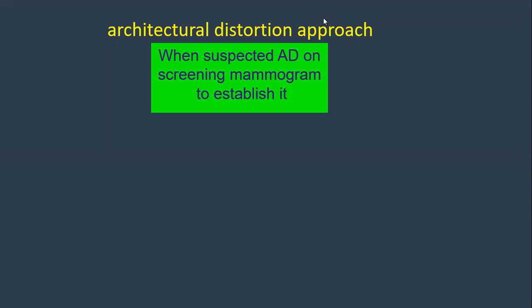Looking for the previous images: you don't want to bring the patient back to do these other views. Yes, it's one of the options also. You will review the previous ones. Excellent. Well, what else?